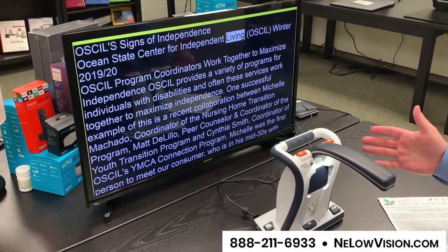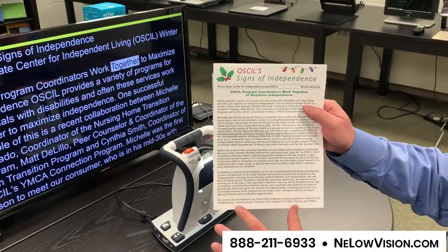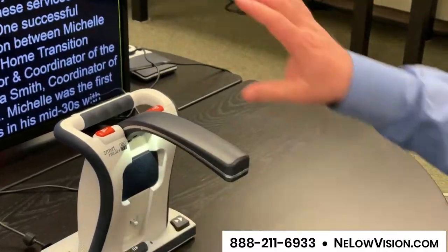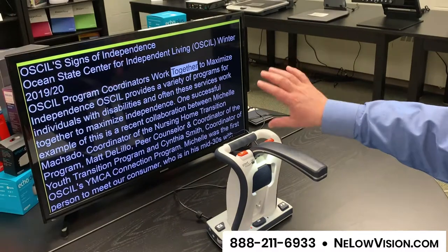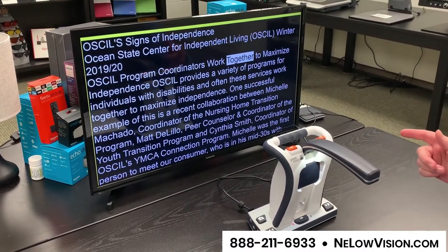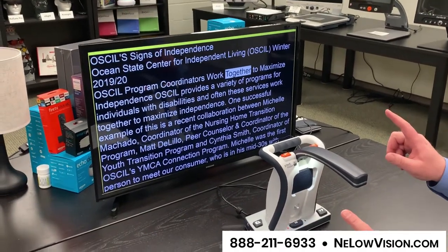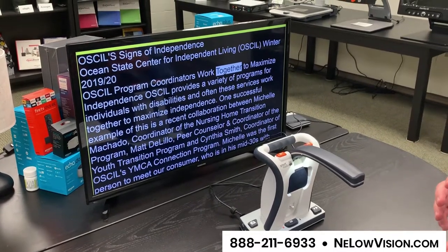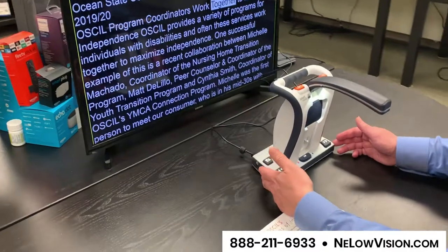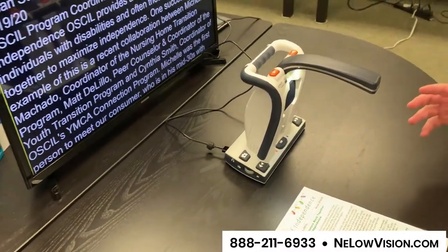It reads aloud: 'Ocean State Center for Independent Living, also winter 2019.' What you'll notice is that it strips away the format — all of the fonts, the spaces, the colors — and makes it one font and one color. Here it's white on black, but you can change that to black on white or a variety of foreground and background colors. It's really nice because if you're going to be visualizing this as it's reading, it's nice to have all of the text wrap right on the same screen. But most people are not using a screen, so I want you to hear the quality of the voice, because I really like this product and one of the reasons is the quality of the voice.